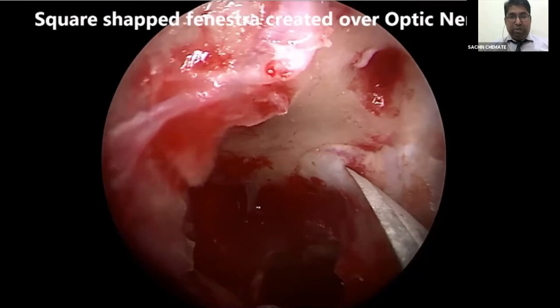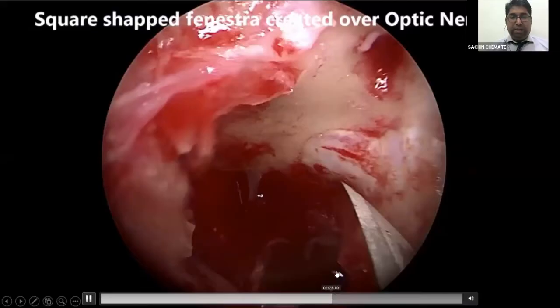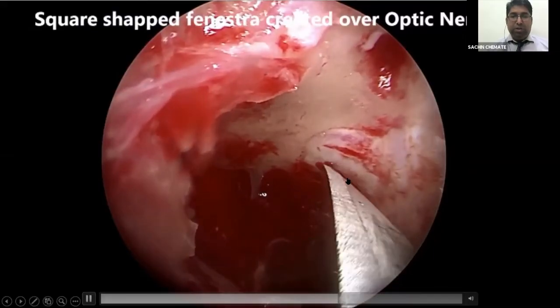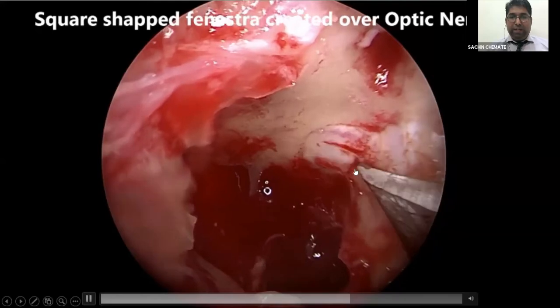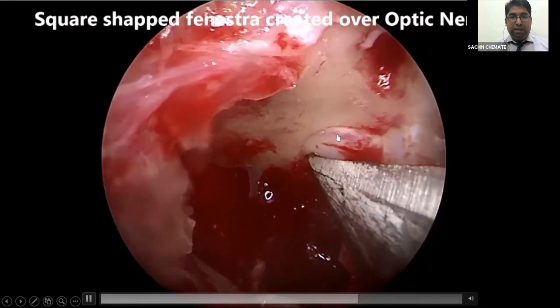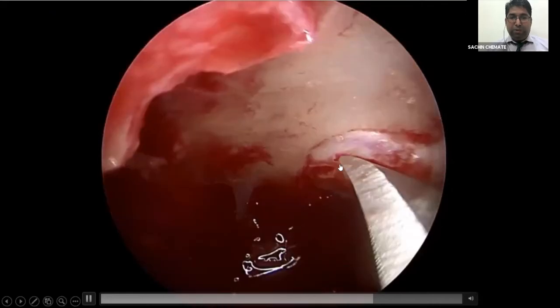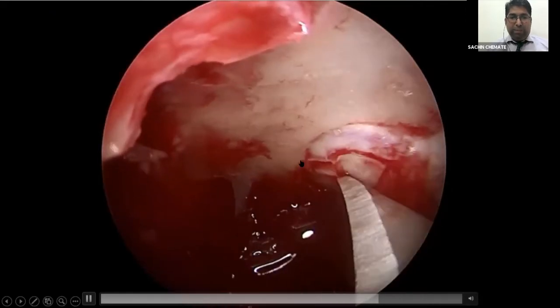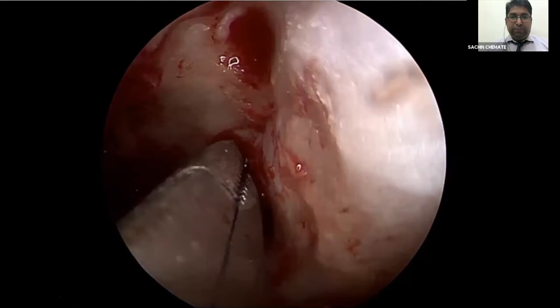The optic nerve sheath fenestration is very, very important. It is technically challenging, and how you do it matters. You have to take an 11 blade, or sometimes you can even use a corneal knife, and create a fenestra or a window there. Make sure you are very gentle and not poking inside, because any small injury to the optic nerve can cause big damage. Your basic target is to remove the sheath without damaging the optic nerve. Once your fenestra is complete from all sides, take a small disc punch and remove that piece of sheath.